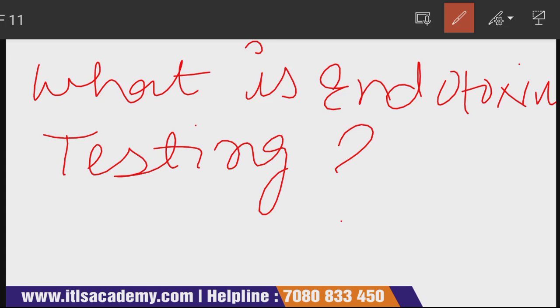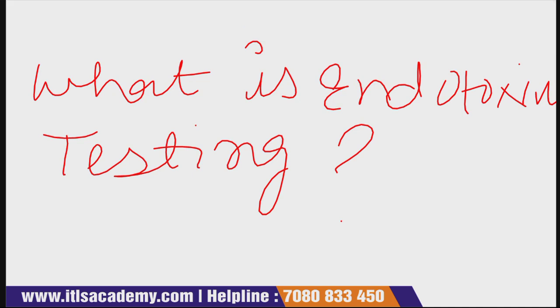Now the second most frequently asked question is: what products need to be tested for endotoxins? Again, this is very important, meaning what are the products? So all injectable pharmaceutical products. I'm again writing the question so you can note it down somewhere.